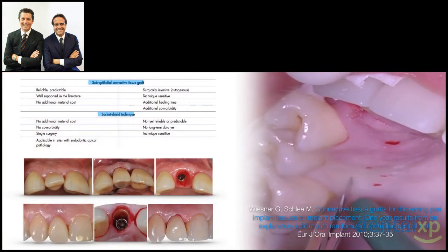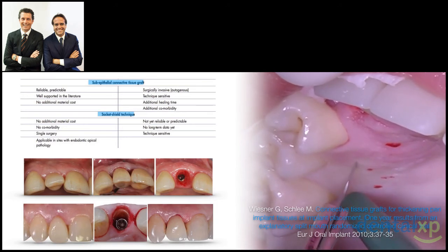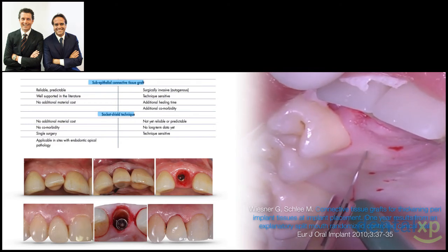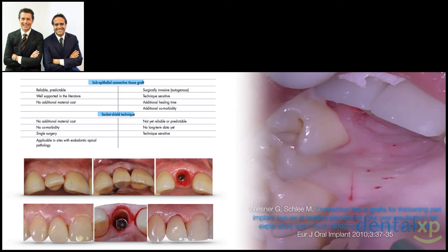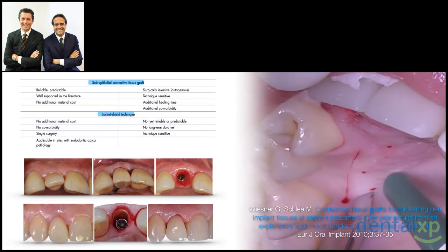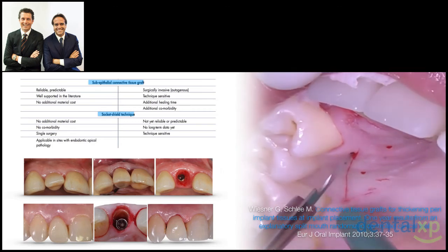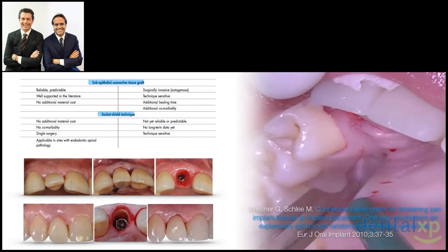And we see also different approaches. For example, we just discussed the partial extraction therapies, we discussed the dual zone approach. Each of these situations has benefits and limitations. But let's see how we can utilize the connective tissue graft, not only, as we saw at the beginning, to manage a complication, but to avoid a complication.